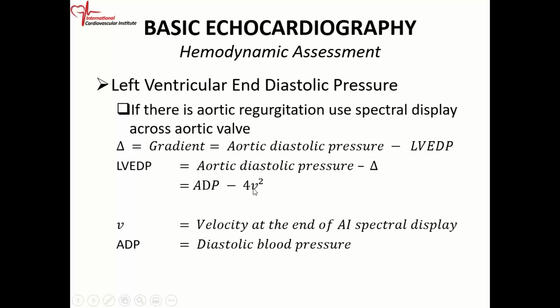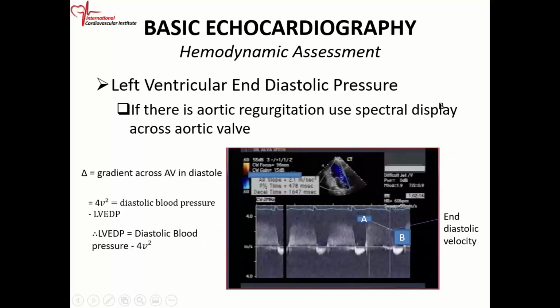So what velocity are we talking about? When you have aortic insufficiency, so again, two-dimensional echo here, your transducer is right there. And this is a three-chamber view. The cursor is across the aortic valve. The sample volume is right at the aortic valve. And aortic insufficiency looks like this. So it's a truncated envelope. It's a diastolic envelope from the end of the T wave to the QRS.